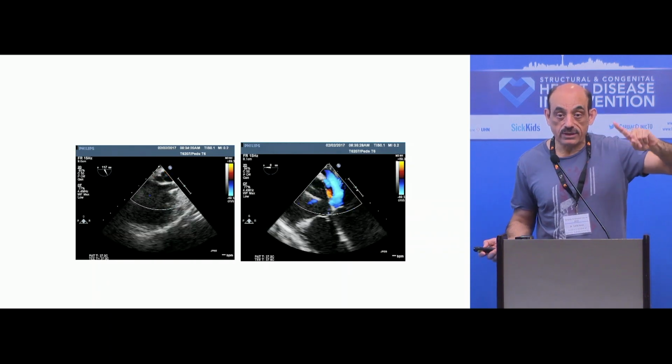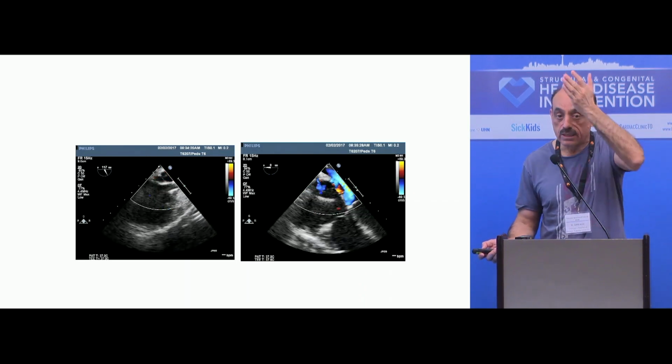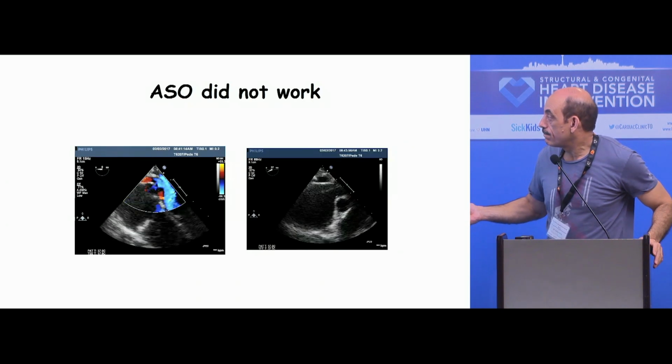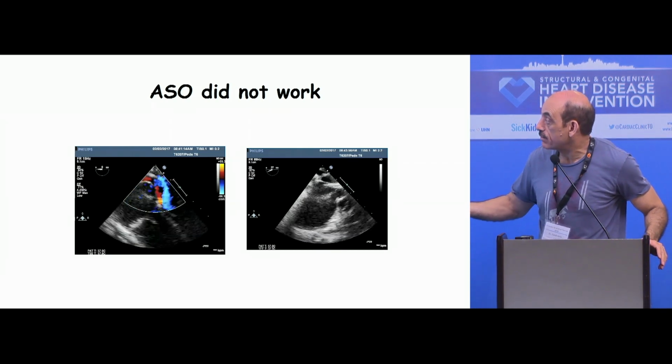And we are not in the back portion. And you did not see the defect in the subcostal view, so it's definitely not posterior or inferior either. It's not in the 4-chamber view. So it is a much more anterior defect. And when it comes to here, you see these 2 septa.